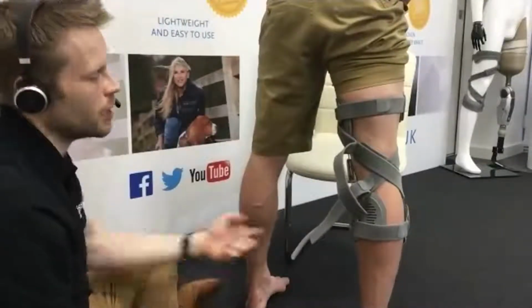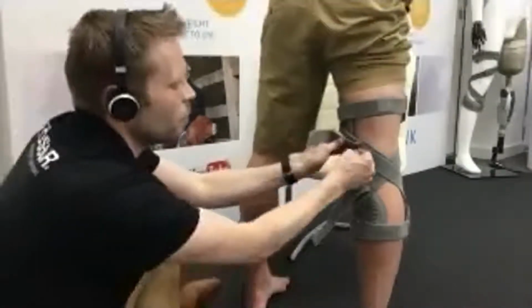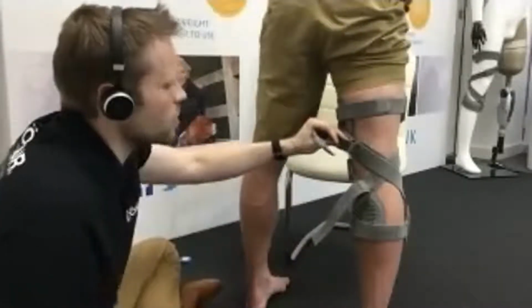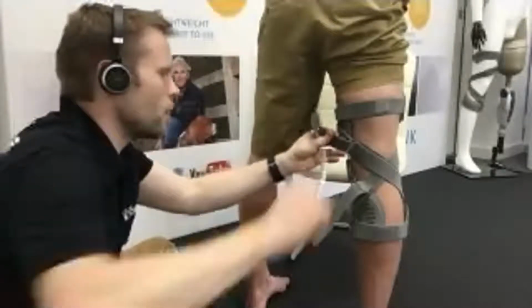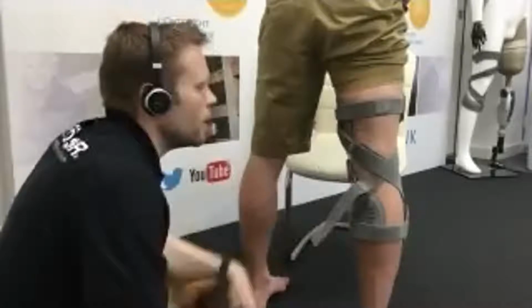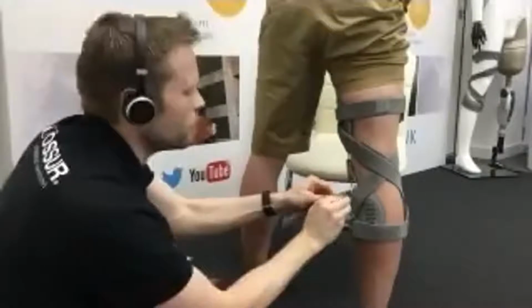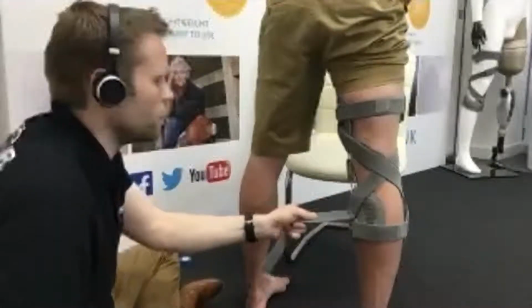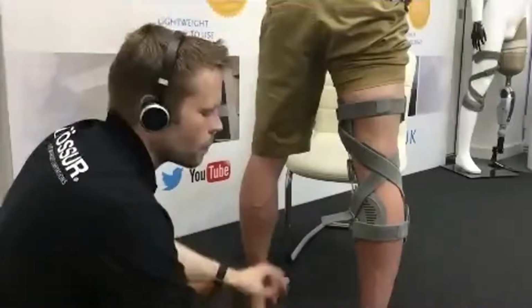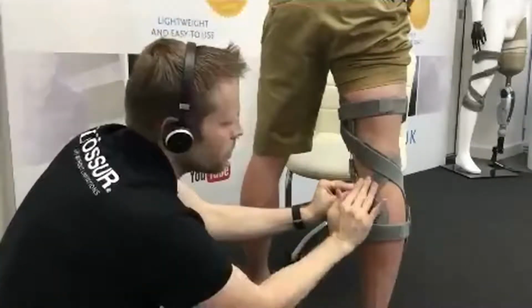So if you're just trial fitting these, you can leave those long, but once we're sure we're happy with the strap length, we can just quickly trim these either side and just make adjustments to that. So I've got my scissors handy. I'm just going to quickly trim this either side and then fasten that over the top. I'm going to make a quick adjustment to this one, trim this one, place our crocodile Velcro over the top and fasten that.